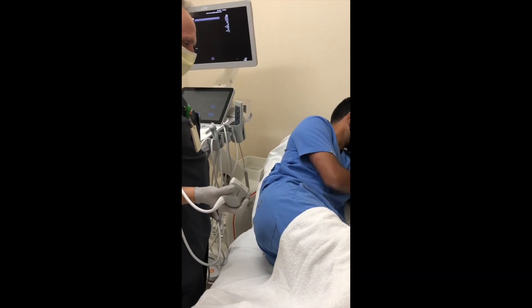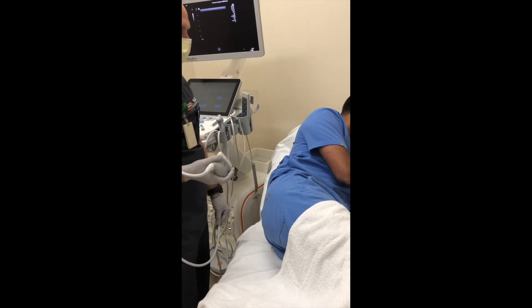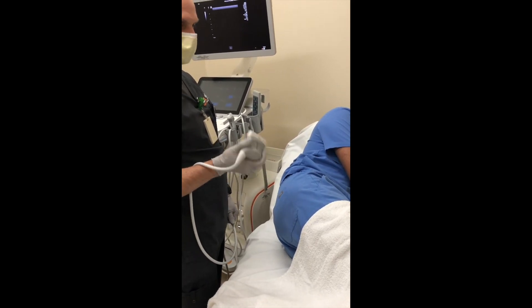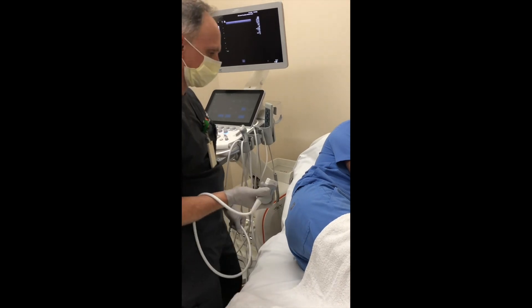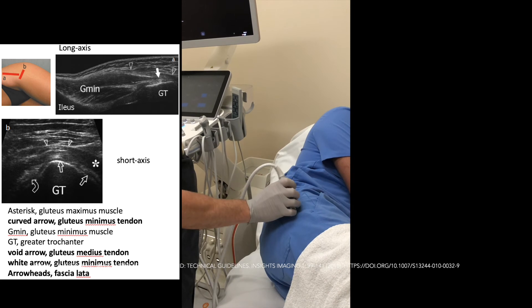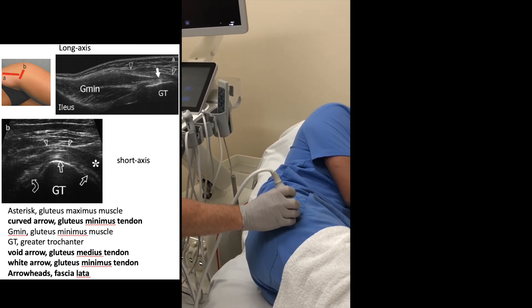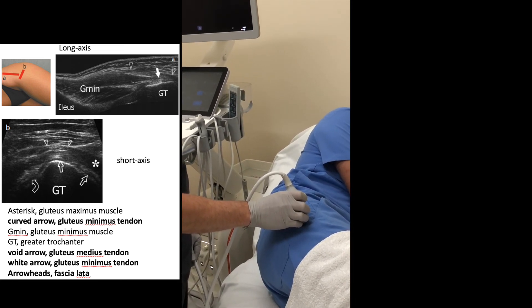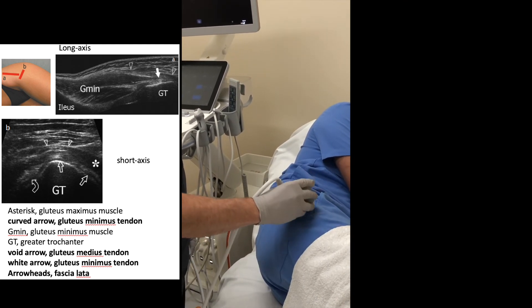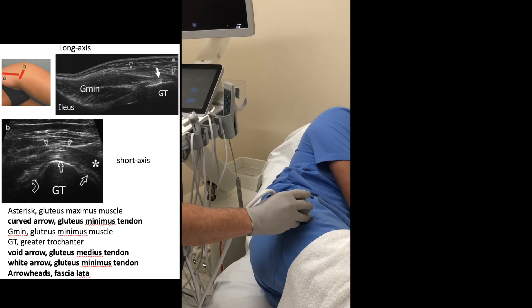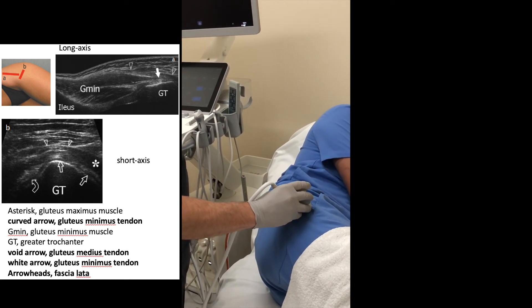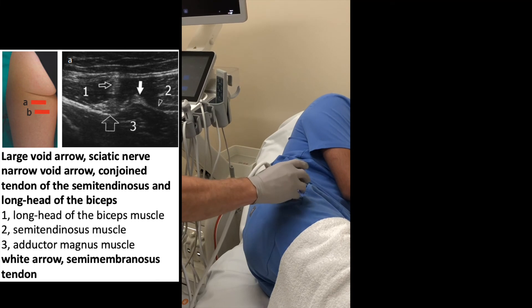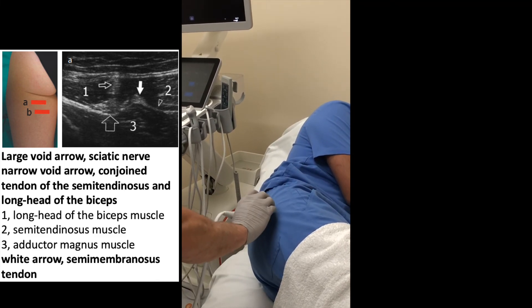To interrogate the lateral aspect of the hip and the gluteal tendon insertions, place the patient in a side position with the affected hip pointing up. The transducer is linear — either 18, 10, or linear 5 — placed along the greater trochanter in long axis. We will evaluate for iliotibial band thickening, gluteal tendon pathology, and greater trochanteric bursitis, interrogating these structures both in long axis and short axis. Then move the transducer in short axis posteriorly to evaluate the sciatic nerve for any sciatic pathology.